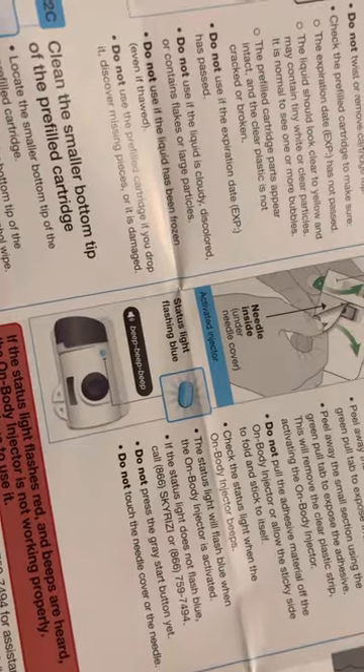Pick your spot — a nice smooth skin so that the device can sit on. Body injector.